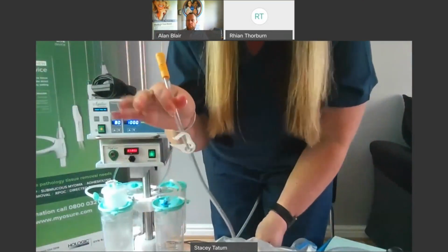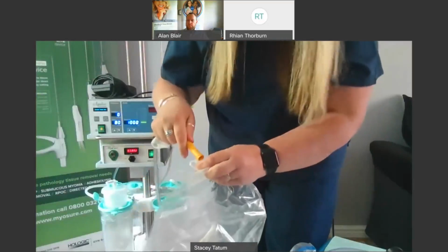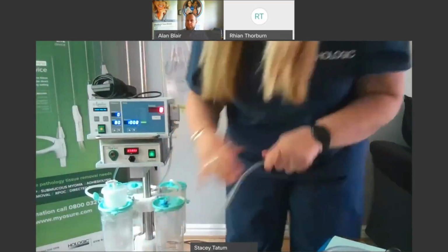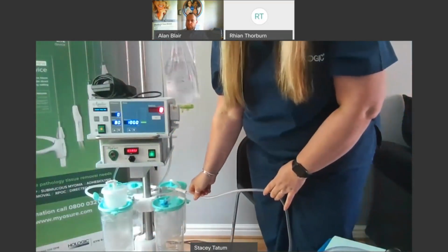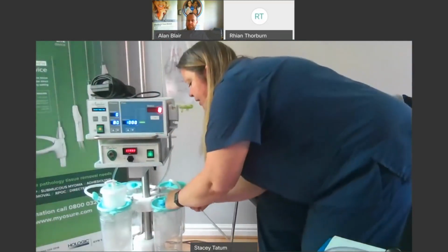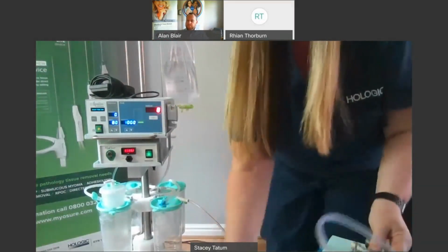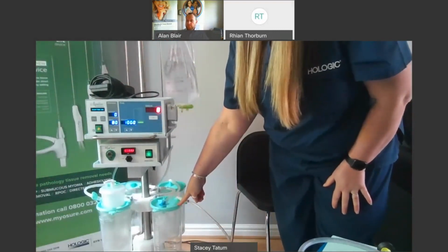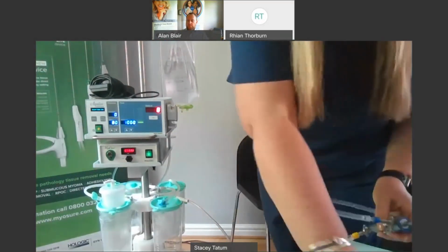It does have a clamp on this one. We don't clamp this off. We just attach it to the tap on the under buttock drape and make sure that it's nice and tight. And then the white end will come off and be attached to the right side canister. So if you want to remember: white to right, nice and tight. Now everything that comes from that outflow channel and your under buttock drape is going to come into this canister, and once it's filled, it will turn over to the back one.